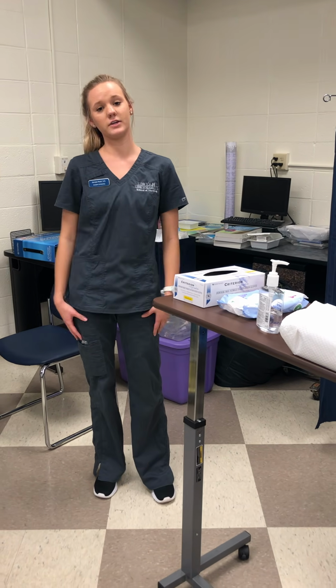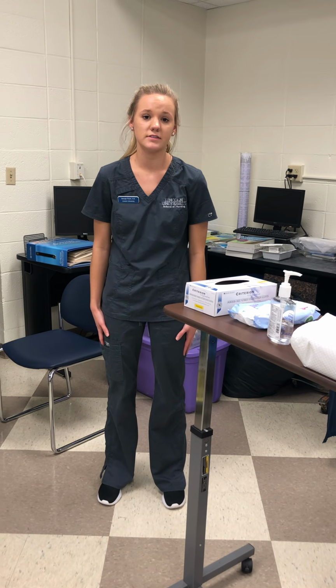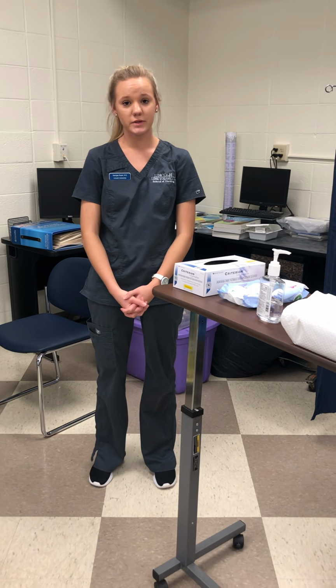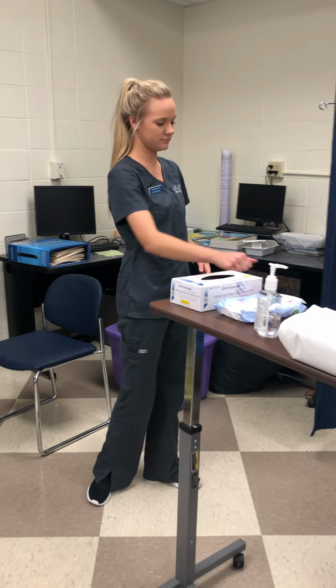So beforehand, I want to make sure that I assess for a physician's order to place the catheter and the catheter size, as well as assessing my patient's condition, last void time and amount, as well as any allergies my patient might have, especially to latex or betadine, because those will be used. So I'm going to go ahead and get started here.